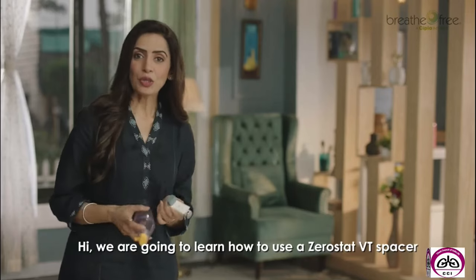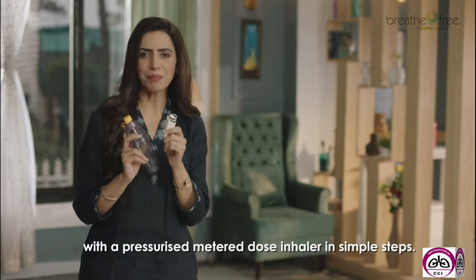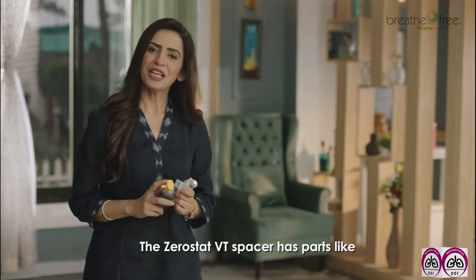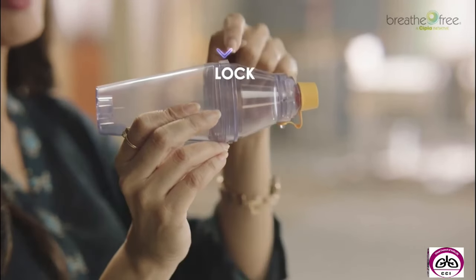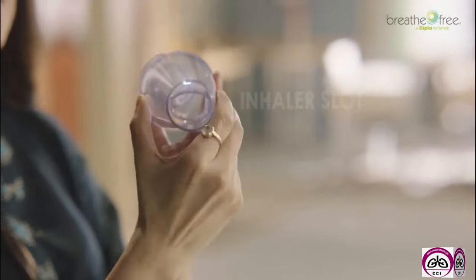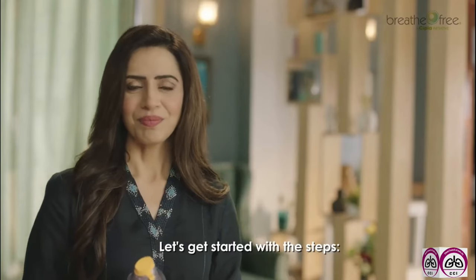Hi, we are going to learn how to use a Zerostat VT spacer with pressurized metered dose inhaler in simple steps. The Zerostat VT spacer has parts like inhalation chamber, a lock, a mouthpiece cap, a mouthpiece and a slot to put in the inhaler. Let's get started with the steps.